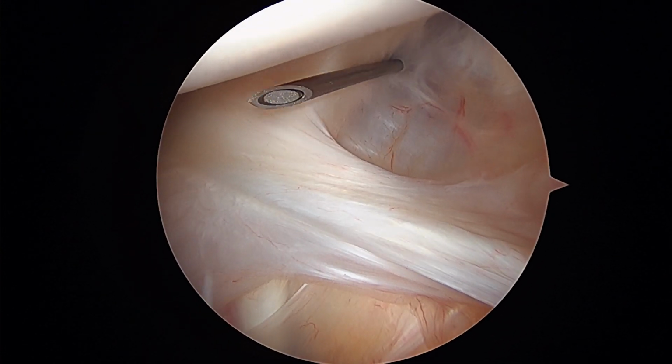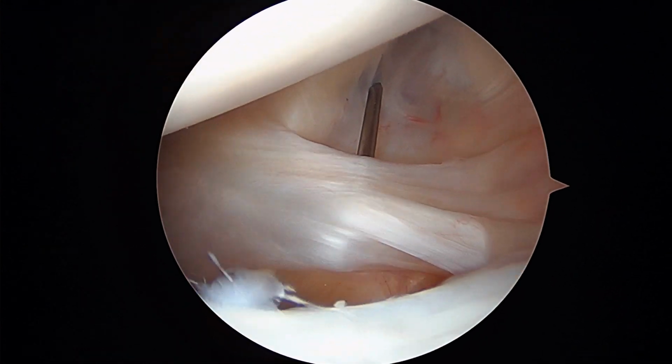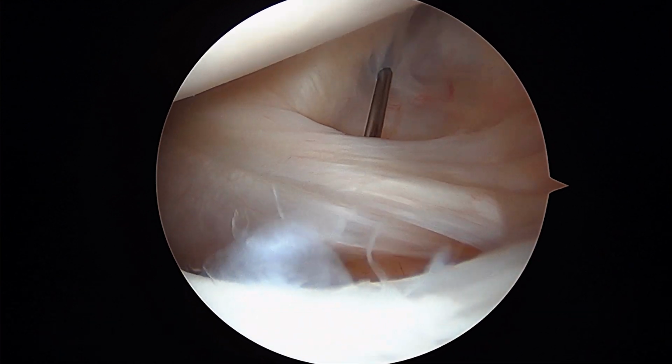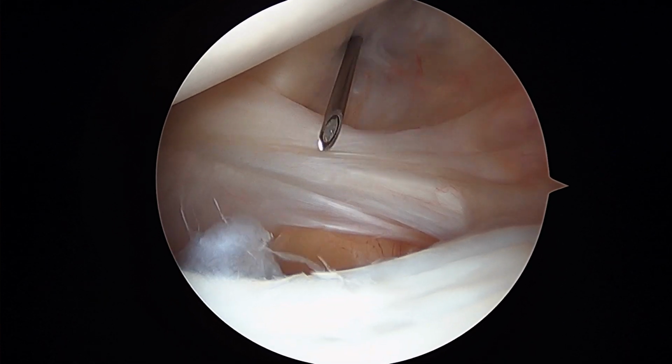You can see it's just above the subscapularis. This is the leading edge of the subscapularis, the superior edge. This is a very wispy middle glenohumeral ligament. You can see how wispy that is. I can almost get all the way underneath it. See that? So there's really not much middle glenohumeral ligament. There's certainly nothing that we could inject.